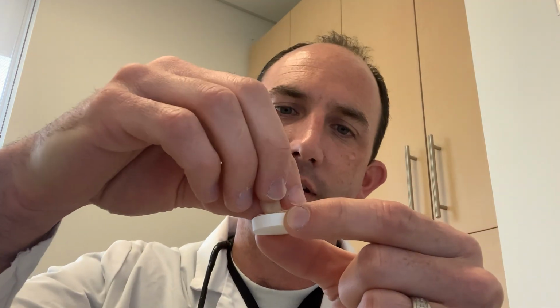Now, in addition to that, we also got a little firing honeycomb with a firing pad. So when you fire the crowns after they're polished or glazed, the instructions, if I read them correctly, are to fire on the honeycomb on the pad on the occlusal surface. Now, if you're working upper anterior, you lay it on the facial, so the lingual's up. If you are working on a premolar, that won't sit on the occlusal, lay it on the side, obviously. But the goal, my understanding, is you just don't want to have it on the margins, because there's some potential that margin may bend under the weight of the crown at firing temperature.